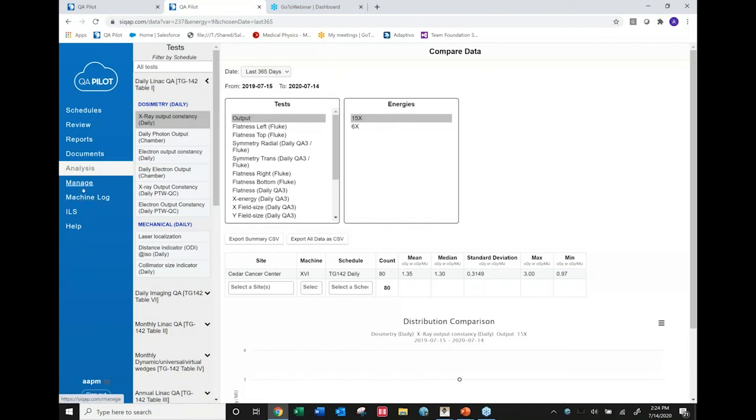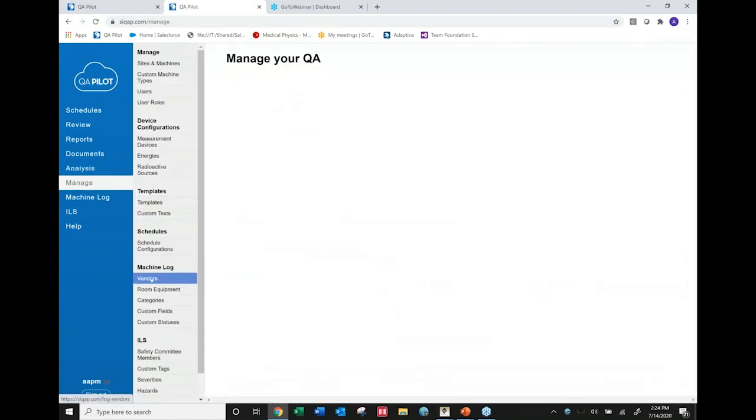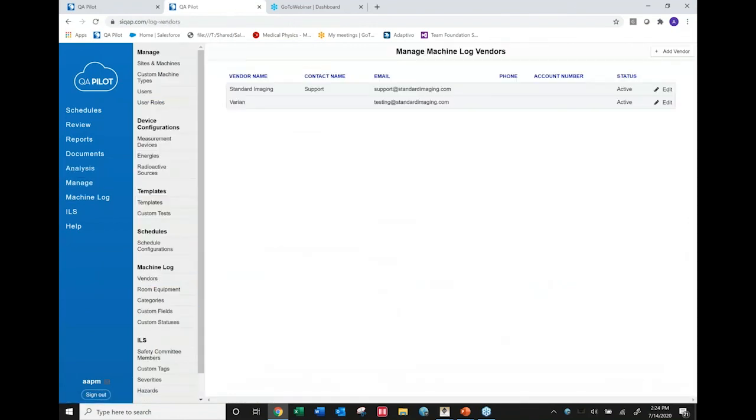Another thing that's really important in here is, we're going to go back into manage to show it here first, but the machine log area, like I mentioned earlier, this isn't just about the Linacs, but it can be about your devices as well. Notice in here we have Standard Imaging as well as Varian. As long as you're putting in an email here, when you actually enter something, create a new machine log incident, you have the ability then to say, okay, email that vendor, and it'll automatically shoot an email off to Standard Imaging or Varian to say, hey, I've got a problem, contact me, kind of thing. So that is actually really interesting.